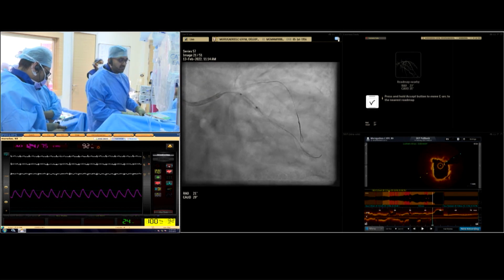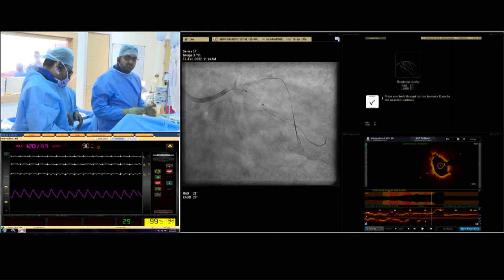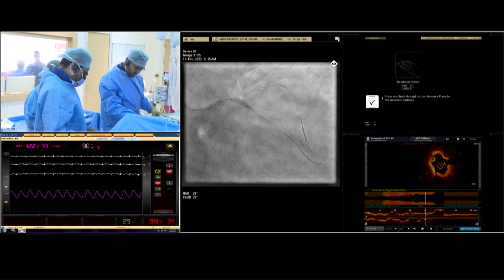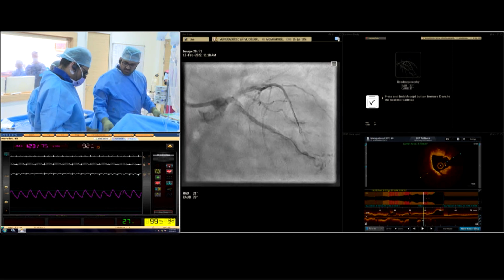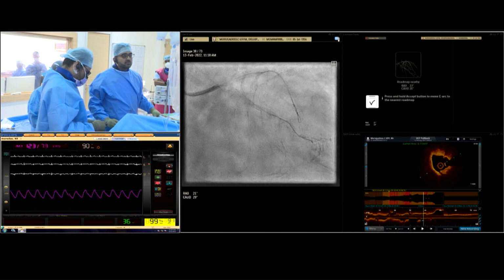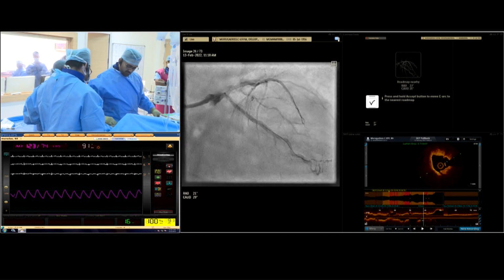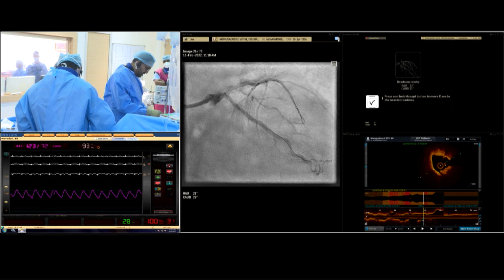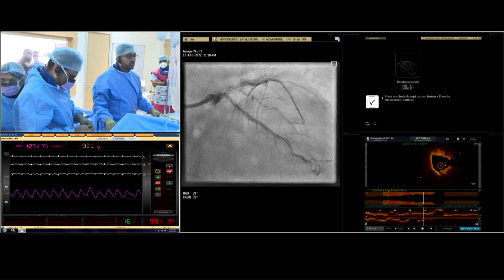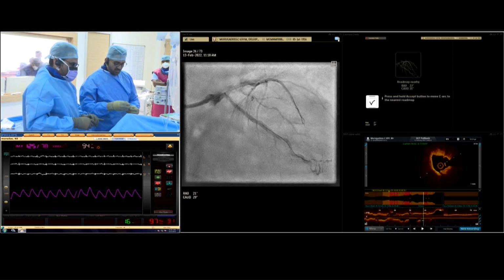Really challenging high-risk PCI scenario case, Gopal. And you are forced to go with a 2-stent strategy. As you rightly said, you would like to initially choose, if possible, a non-dependent strategy, but of course here you had to use 2 stents, and you have done the initial circumflex preparation well. Now, as you rightly have shown, without an IVL, it could have been tough to prepare. You have produced balloon cracks in the LAD, but definitely there were calcium cracks as well. So you have done the job with IVL, and now DK crush is the right way forward here. I think you are on the right track. We'll be interested to see how you proceed with the other steps.